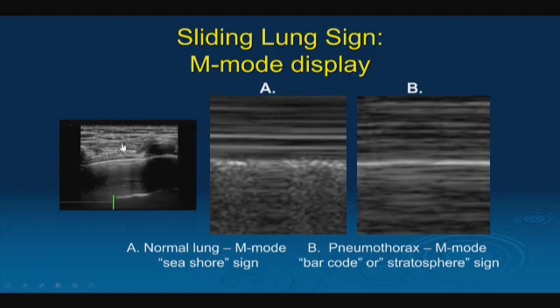And what we see first would be chest muscle, right? So the chest muscle doesn't move, the pec muscle doesn't move. So all this from the top of the image to this bright white line that's moving here is muscle. And then we see a black streak and a black streak here. That's shadowing from the ribs. So when we look between the two ribs and we see this bright white line here, you see it shimmering back and forth. So that's what we should see in a normal lung.